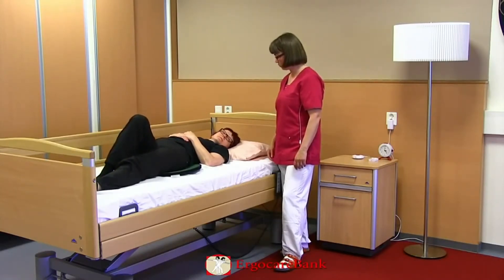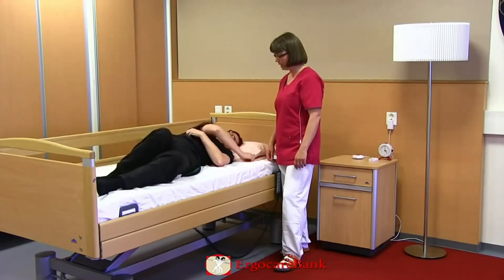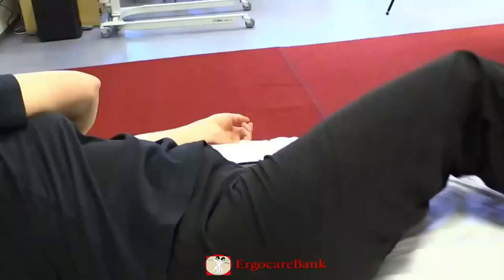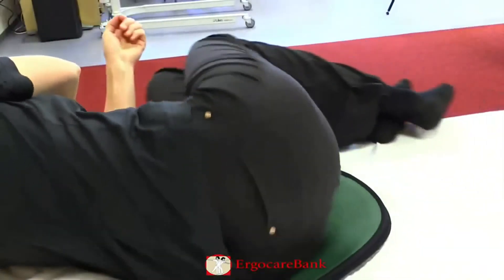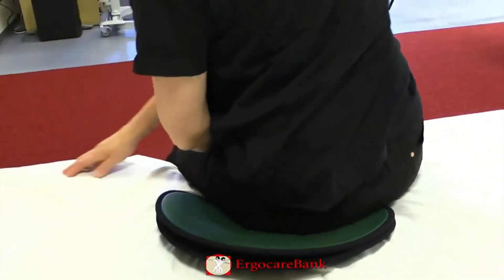Amanda swings her legs over the side of the bed, pushes off with her arms, and the disc helps her sitting up.